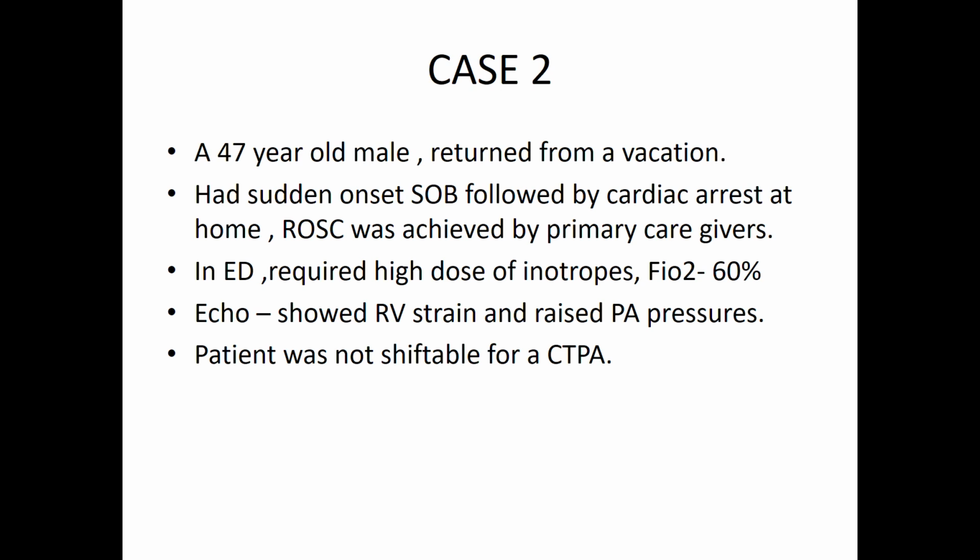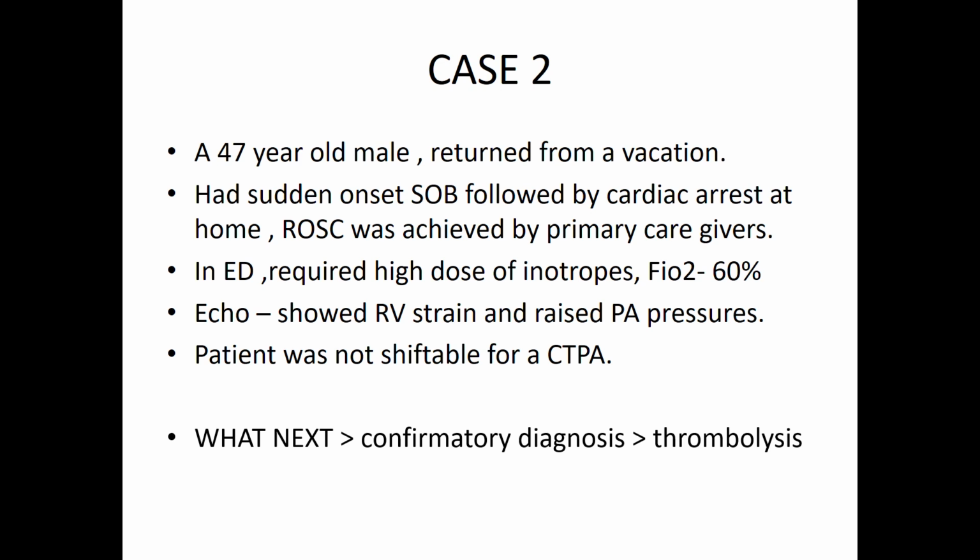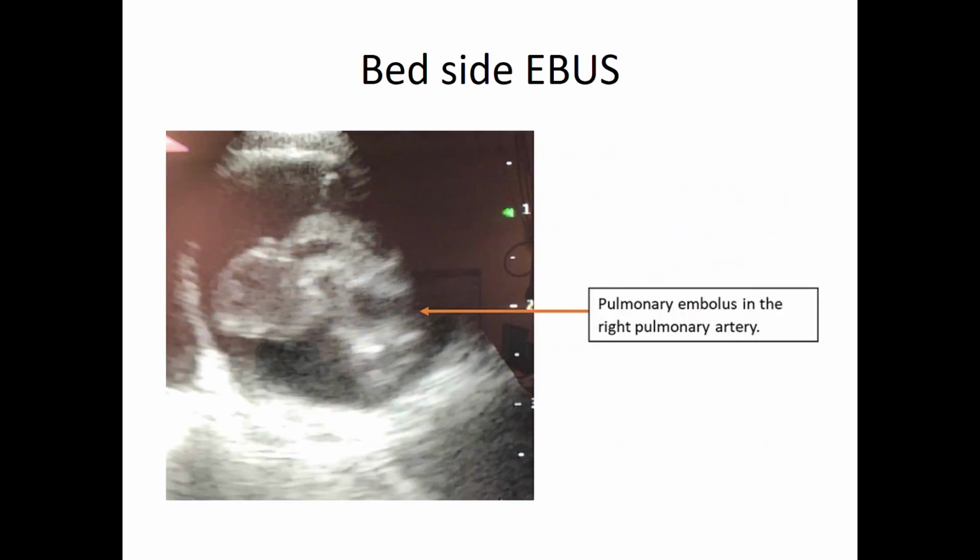However, when a patient of pulmonary thromboembolism is in shock, a lot of the times you cannot transport that patient for diagnosis or for CTPA purposes. So, you can empirically thrombolyse the patient based on the echocardiography finding, or is there anything to support you medico-legally as well as for the patient's benefit? In this case also, the echo or the bedside EBUS may be helpful to clinch the diagnosis.